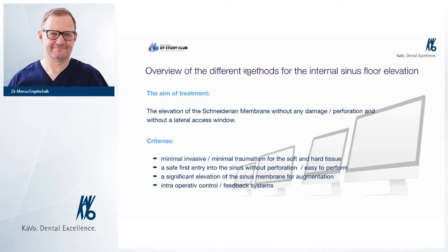This is very important information for you as well as for your patient, because for the patient it means that he has to come for a second operation too. And for you it's very important because you have to choose the kind of implant you will be using, the form of implant. Well, it can change if you use a simultaneous sinus floor elevation in combination with the implant, or if there is enough bone and you just have to place your implant. So this is the second information we can have from this cone beam scan, that we see there is enough bone and we can bring in the implant and the augmentation.